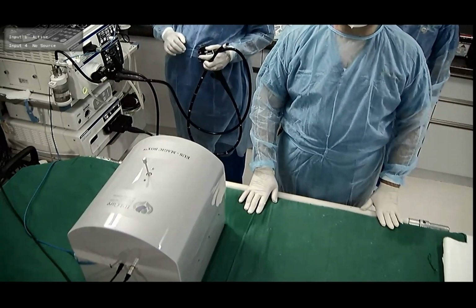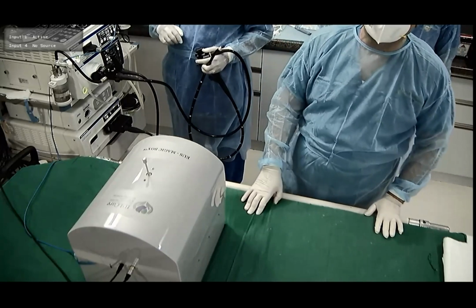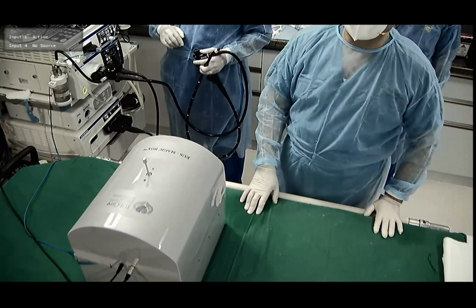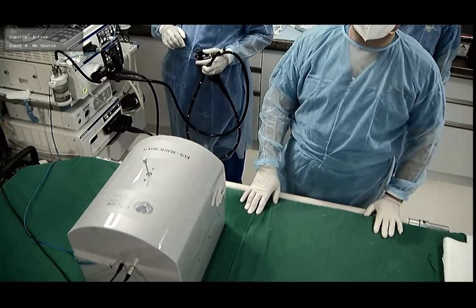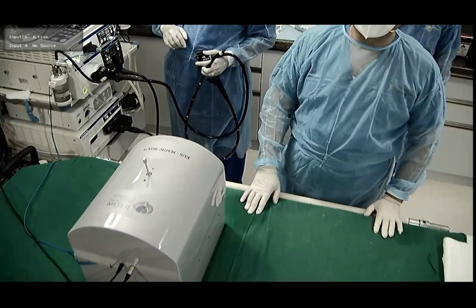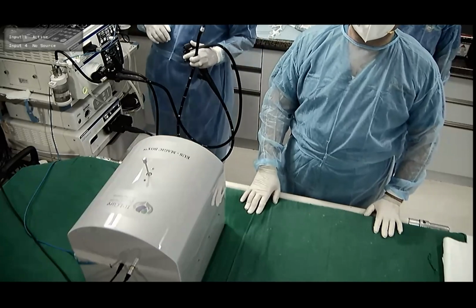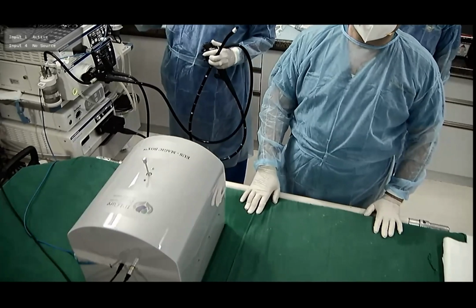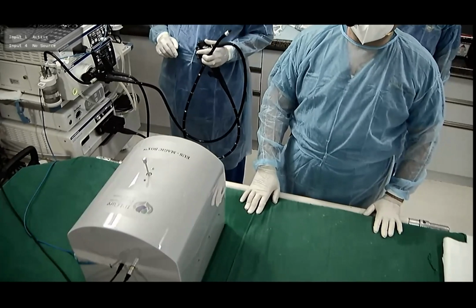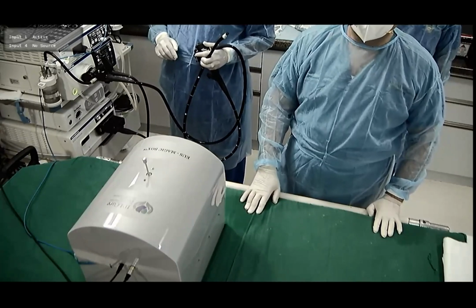There are multiple other models also. The Asian EUS group has been pioneering. Professor Kida has created a very nice model, which some of you must have used for CDS and HGS. The Thai group has created a very nice model. And I think Anthony has a very nice model for gallbladder drainage. So learning on models is the way to go, and that is why this magic box has been created.